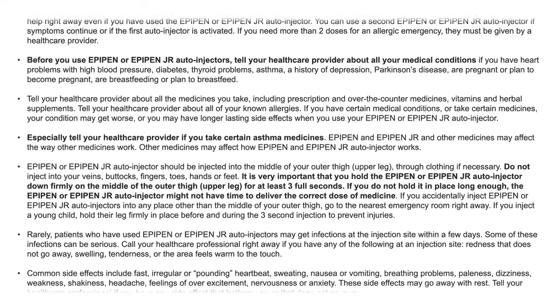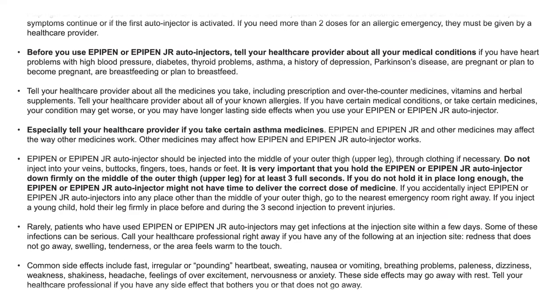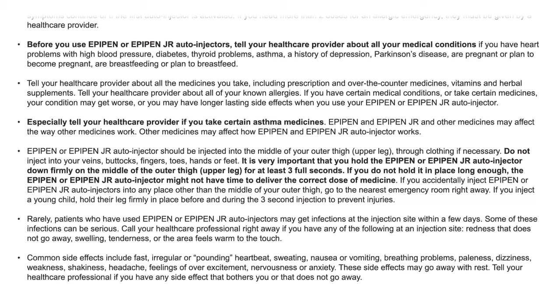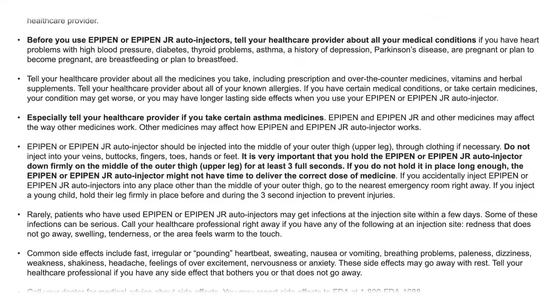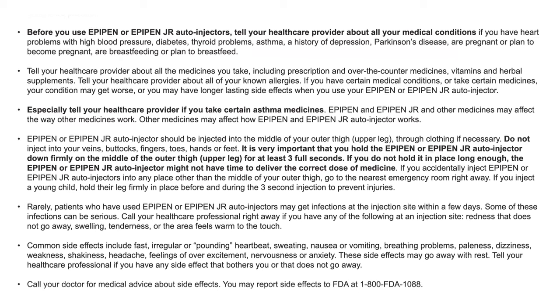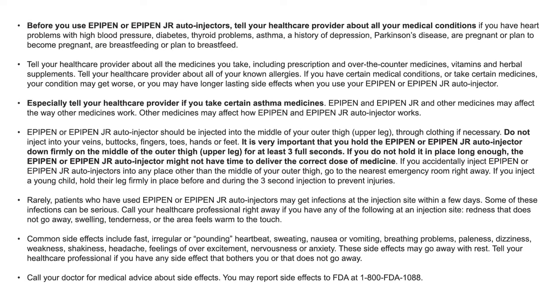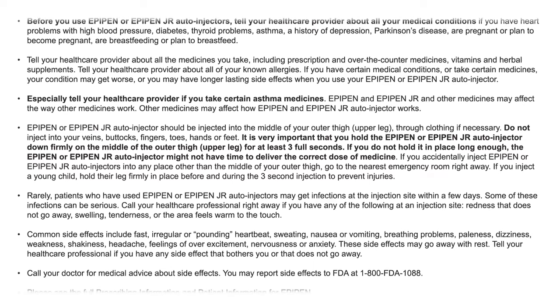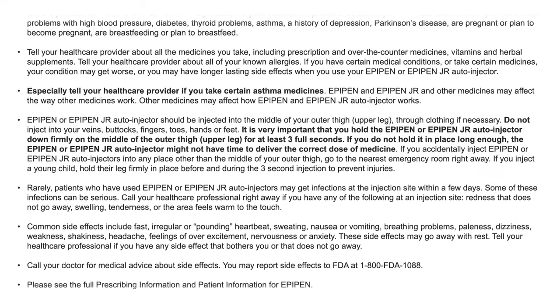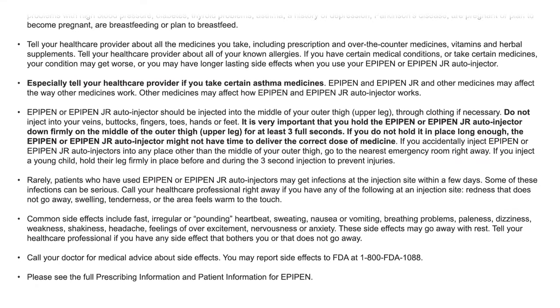EpiPen or EpiPen Jr. auto-injectors should be injected into the middle of your outer thigh or upper leg, through clothing if necessary. Do not inject into your veins, buttocks, fingers, toes, hands, or feet. Hold the auto-injector firmly on the outer thigh for at least three full seconds. If you do not hold it in place long enough, it might not deliver the correct dose. If accidentally injected anywhere other than the outer thigh, go to the nearest emergency room right away. If injecting a young child, hold their leg firmly before and during the injection to prevent injuries.